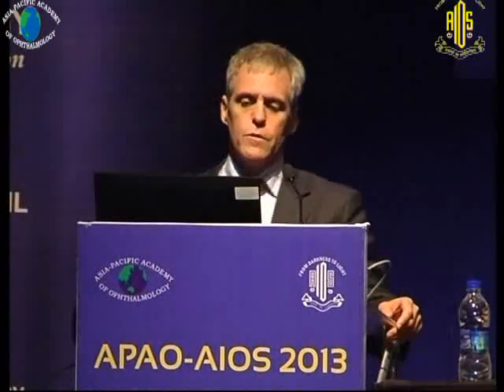Okay, we'll talk now as a retinal surgeon being referred these cases with dislocated cataracts or IOLs. There's a whole lot of decisions we need to make. At the top, how do we access the eye? As I said, if they've got choroidals, the Lewicky infusion is a good way to get started. Next decision is how are we going to remove the cataract? We may need to remove other bits of paraphernalia that our anterior segment surgeon has inserted into the eye, such as IOLs and Morcher rings that have dislocated posteriorly.